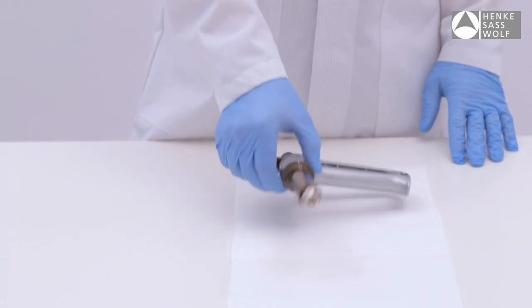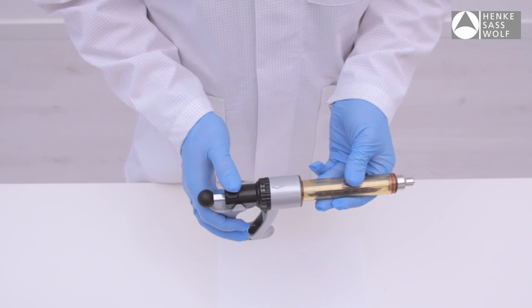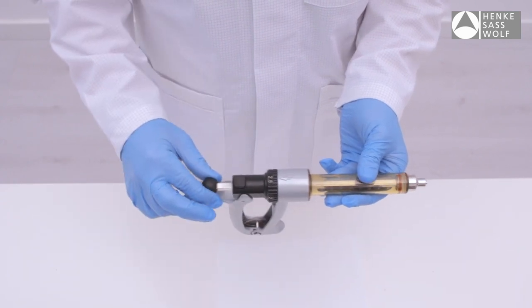Prior to disinfection, the syringe has to be disassembled. In order to do so, press the locking sleeve and pull back the piston rod.